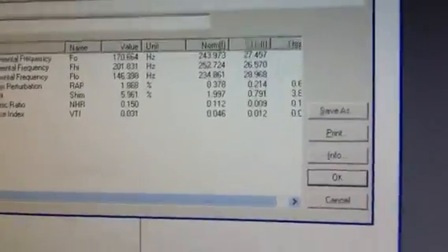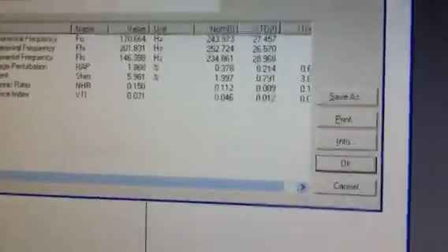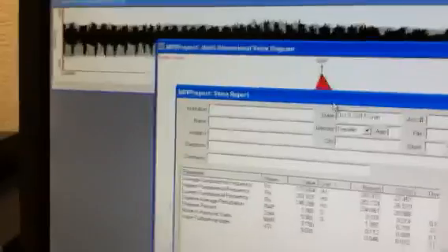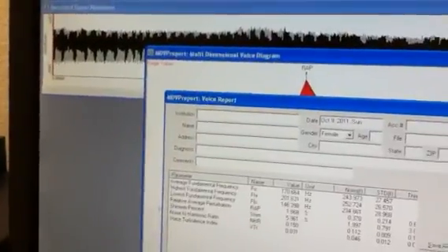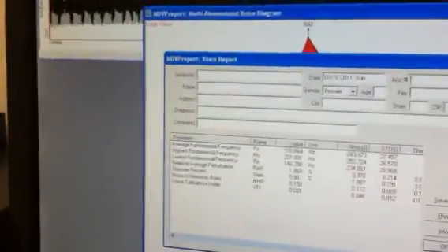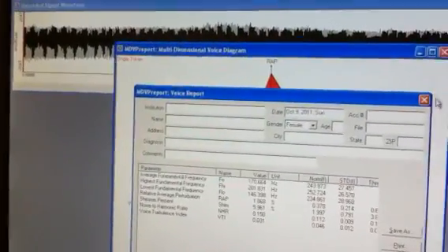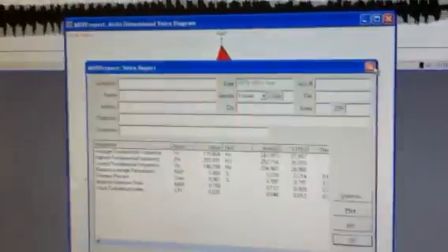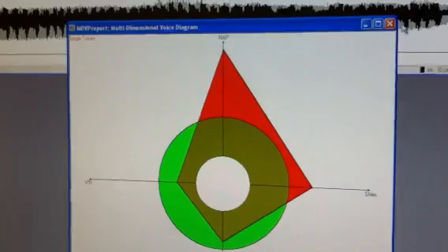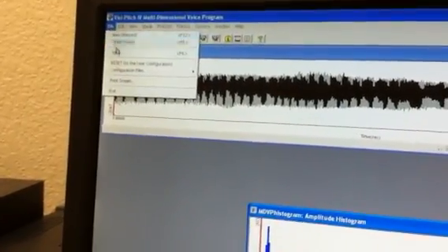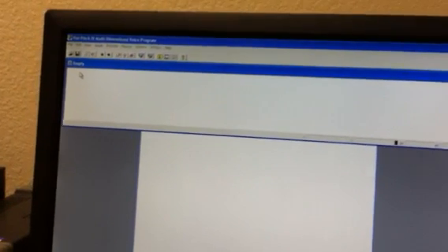You're finished with the perturbation measure. One thing I wanted to show you is, in order to clear data, you can't record over it. You have to go up into file and reset the data screen to eliminate all the data that's there in order to collect additional data.